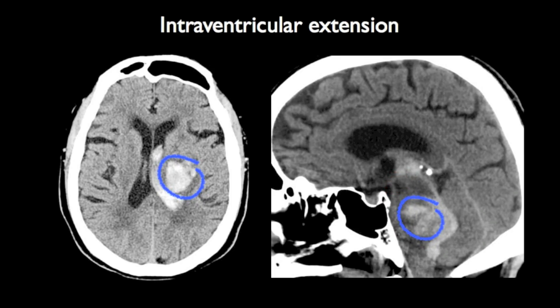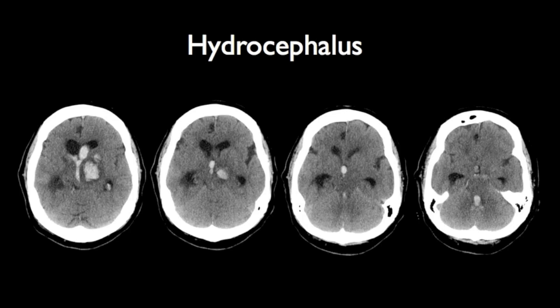When such extension occurs, it is not surprising that obstructive non-communicating hydrocephalus develops, as is seen in this case with marked prominence of the temporal horns and some early transependymal oedema. The overlying sulci are also effaced.